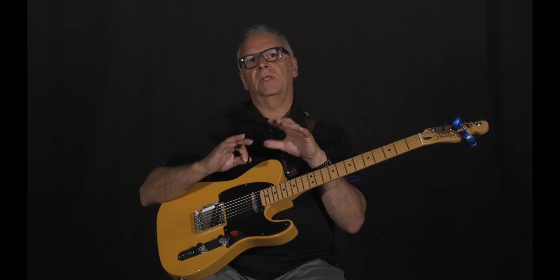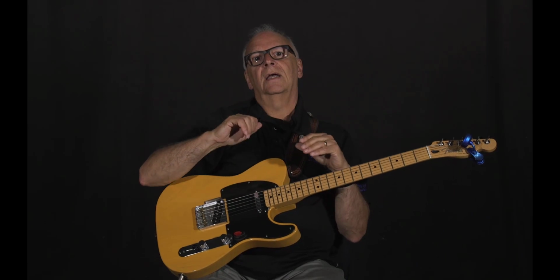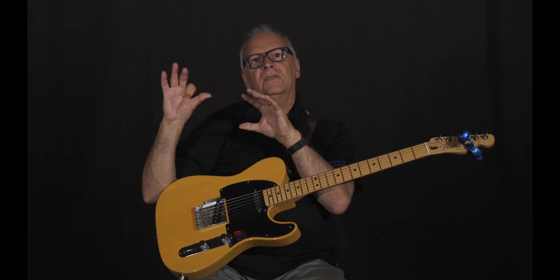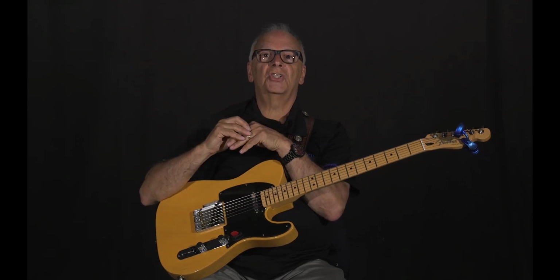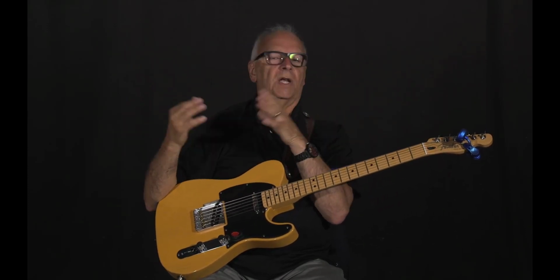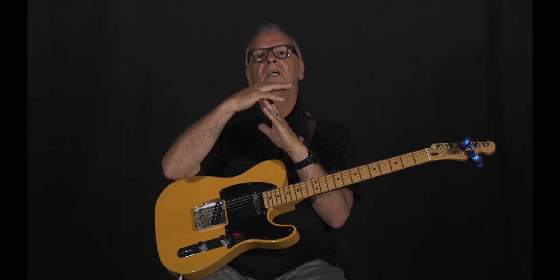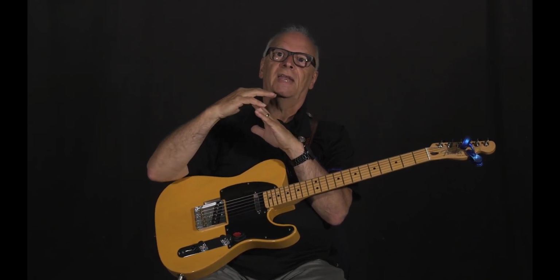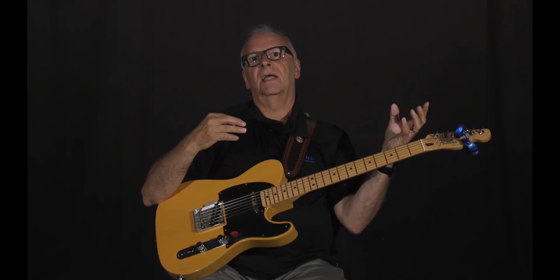So the parallel between tension in the equations that we just described, T on the guitar, and the Teslas, or the specification of an MR machine, 3T machine, 4T machine, 1.5T machine, that refers to the Teslas, and that refers to the magnetic field strength on MRI. And these are parallel concepts between the guitar and the MRI scanner.